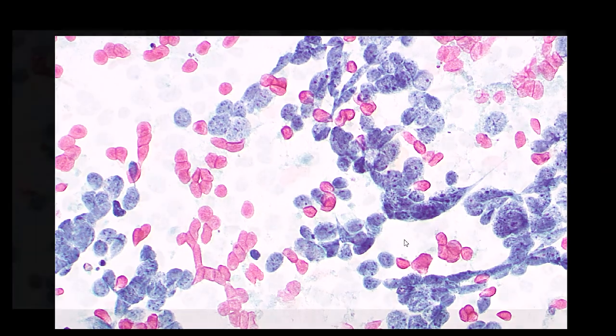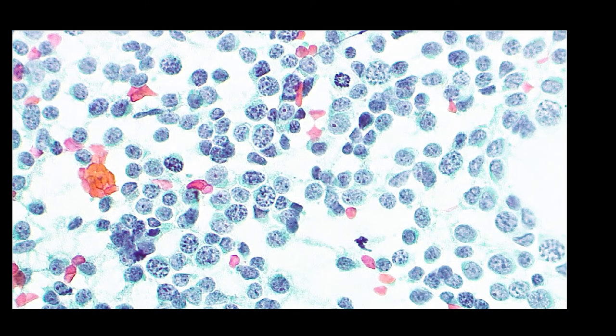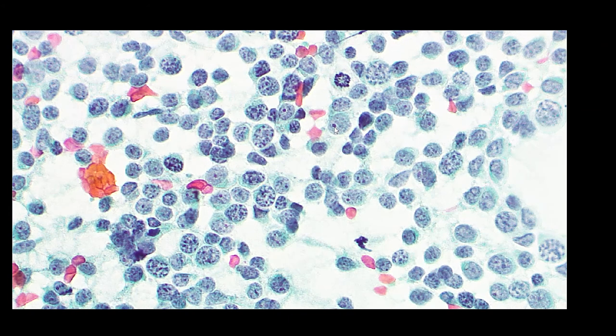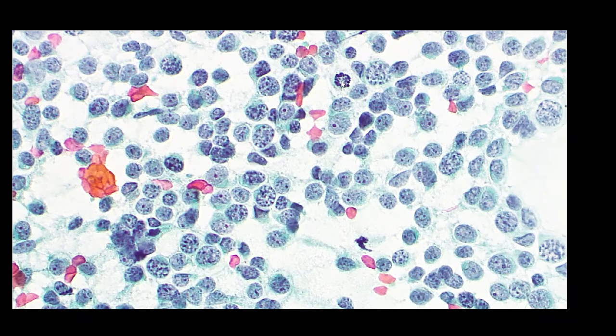And yet another case, again really nice stippled chromatin, in this case variation in size and shape, high NC ratio, possibly little nucleoli in some of these I'm pointing out, but great chromatin. So the pap stain is really useful in neuroendocrine tumours.